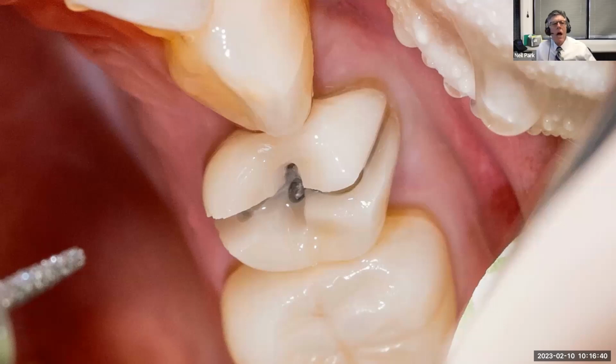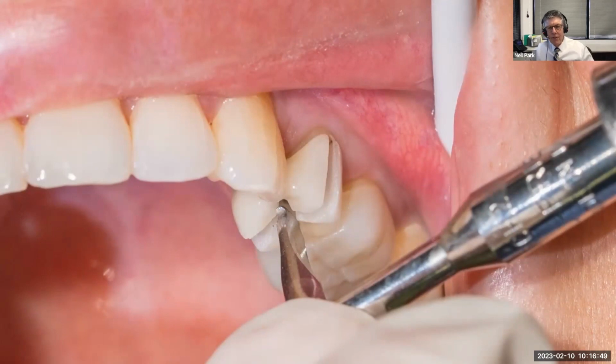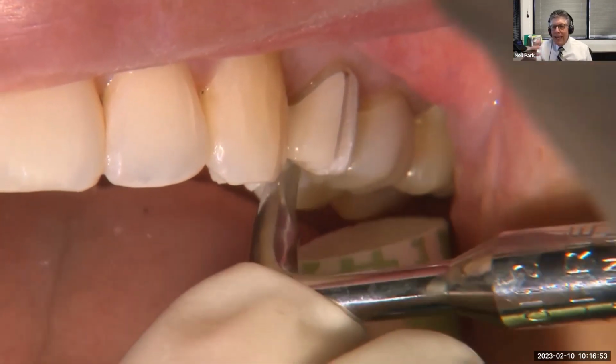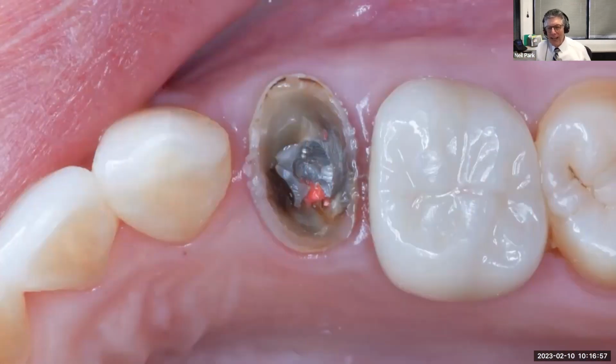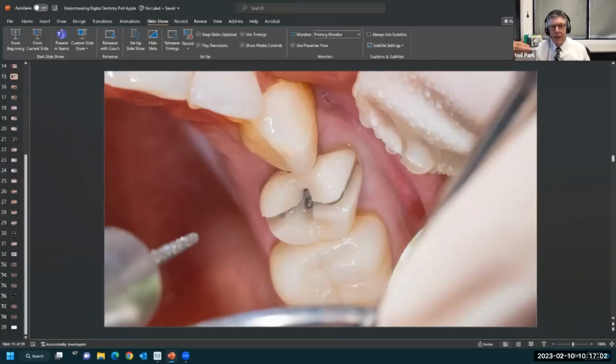Okay. Well, good. So I got a question here about grooves, boxes, and shallow pinholes, asking if it's captured in the digital design. So I guess the first question is, it has to be captured in the scan, right? First of all, in order to get into the design software, and then can you design crowns that fit into grooves, boxes, and shallow pinholes? So that's a tough one.